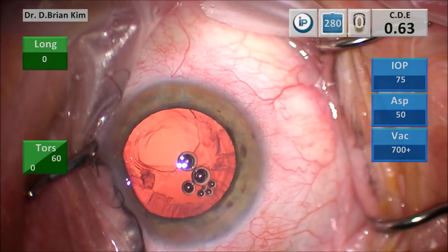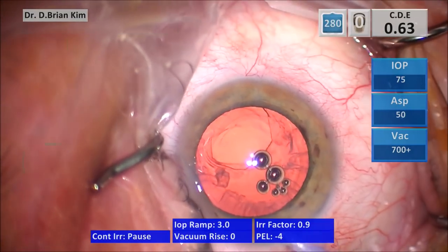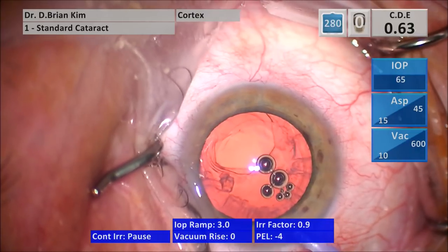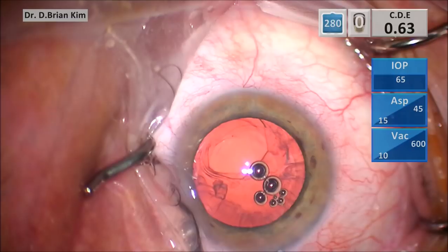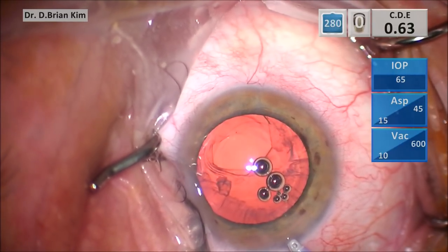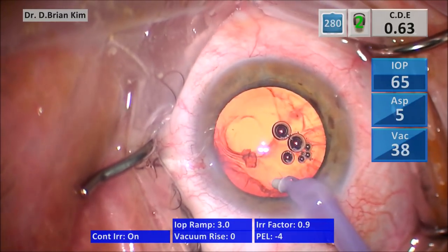I still have a lot of cortex left, and so I'm going to go back into mechanical I and A, but I've asked my technician to cut the IOP down to 30. And so she's in the process of doing that. And IOP with a Centurion is reflective of bottle height. Of course, there's no bottle with it.